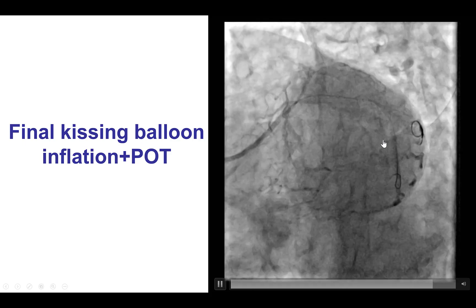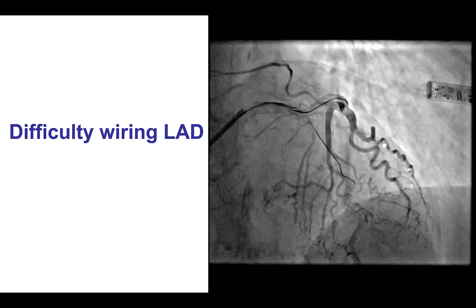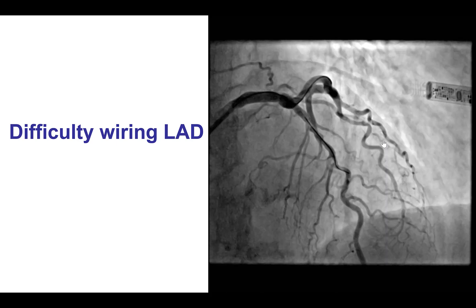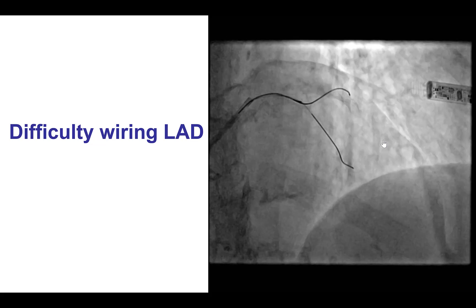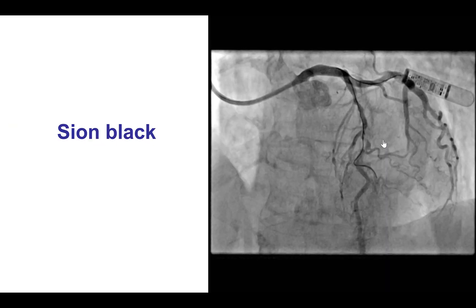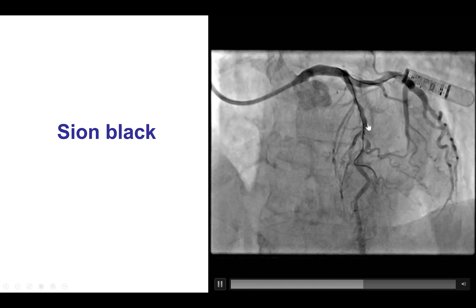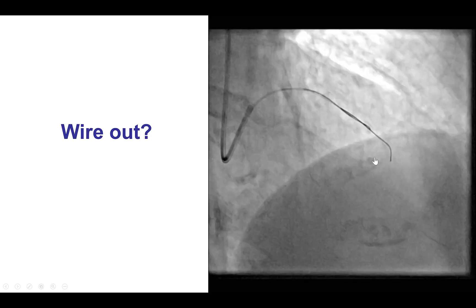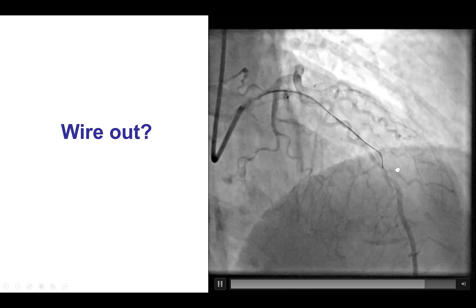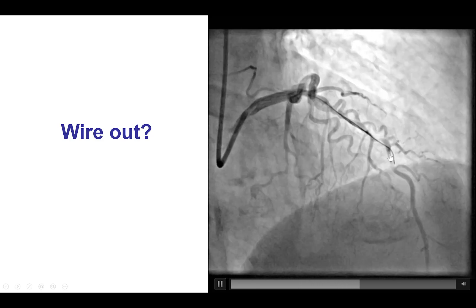At this point we had used a relatively small amount of contrast and radiation and we decided to treat the LAD. We did however have a lot of difficulty advancing a guide wire through the mid-LAD lesion. We tried with the Sion blue as well as a Samurai wire but had a lot of difficulty, and eventually changed to a polymer-jacketed, non-tapered, soft wire — the Sion black. Unfortunately, as we can see here, the Sion black is going into a diagonal branch and seems to be slightly outside the vessel. In a different projection it is clear the wire is actually no longer within the lumen and has likely entered into the subintimal space.